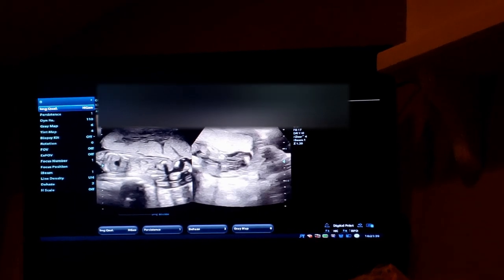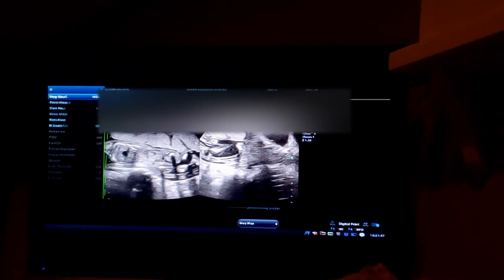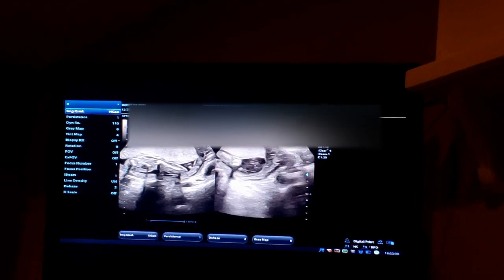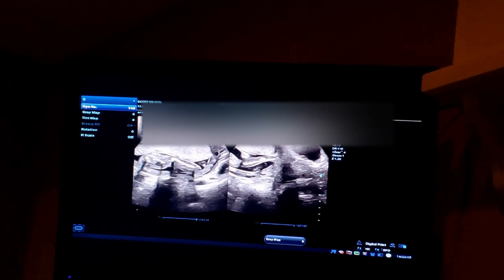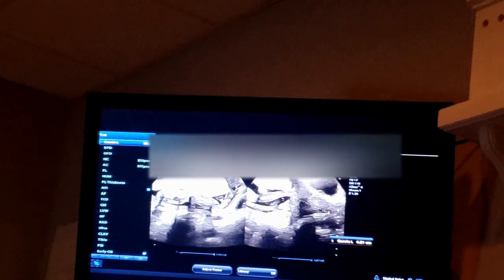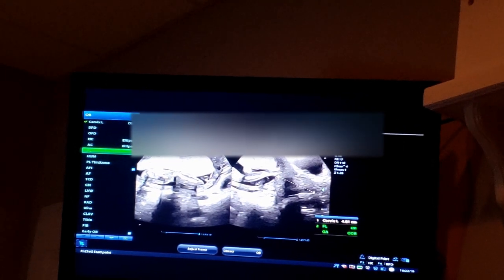Hit the birth canal first. So far, I don't understand anything. I'm looking at the leg, birth canal. This is where the baby comes through. We have to check it, make sure there's nothing in the way. And then this is the femur, the upper bone in the leg, measured from hip to knee.